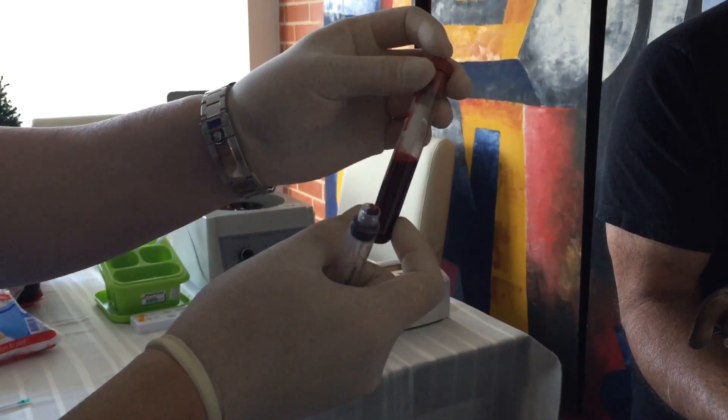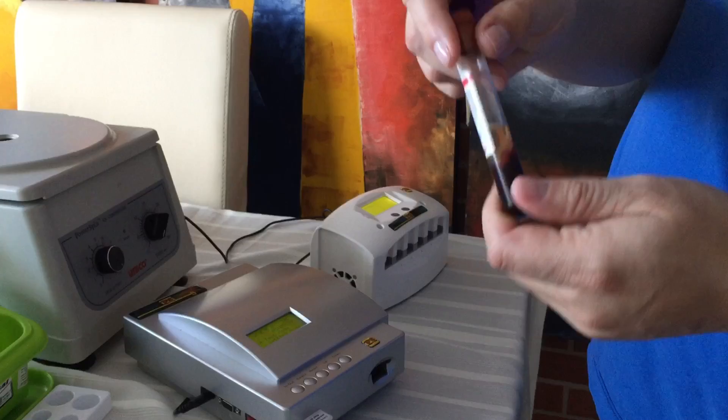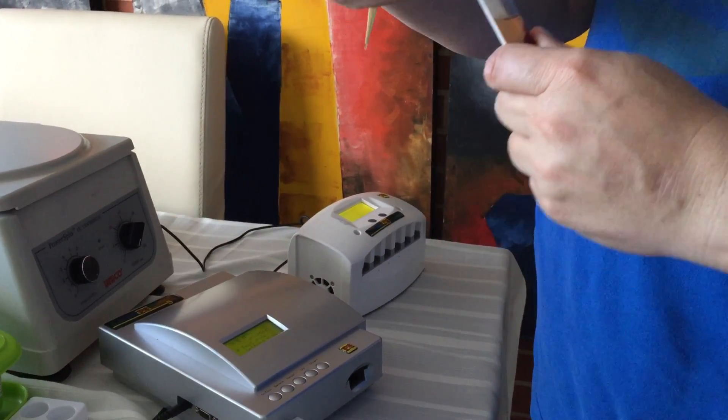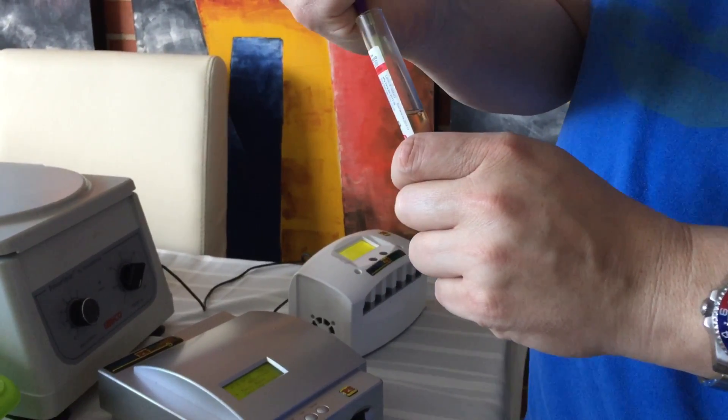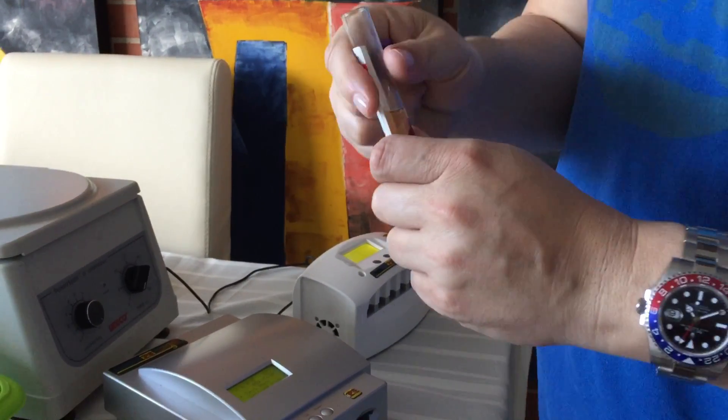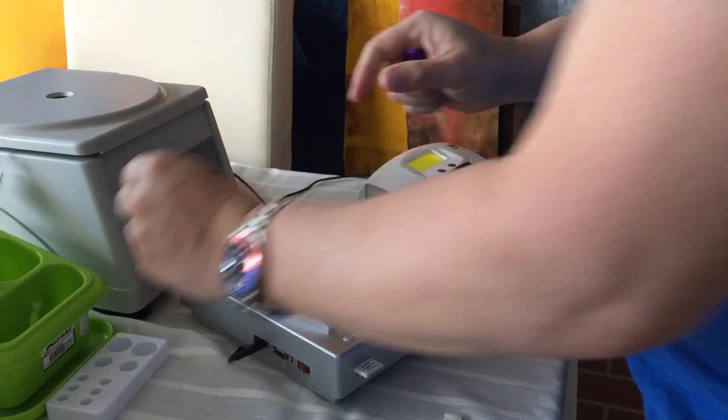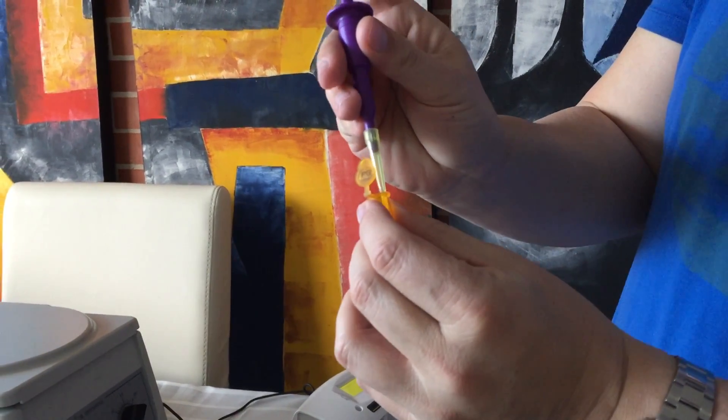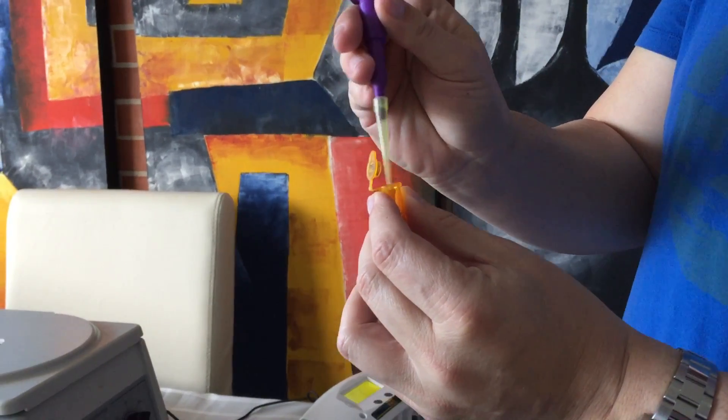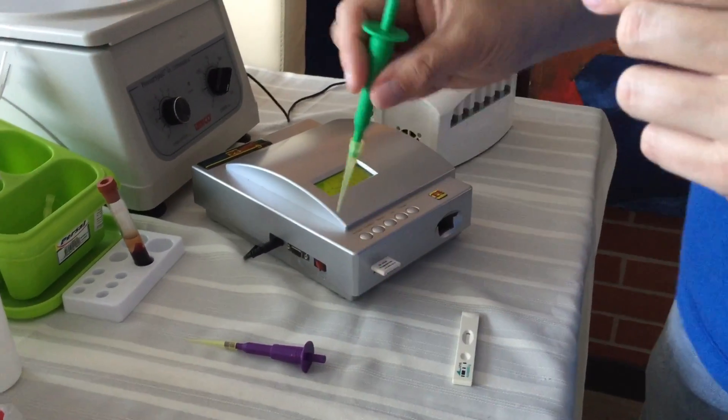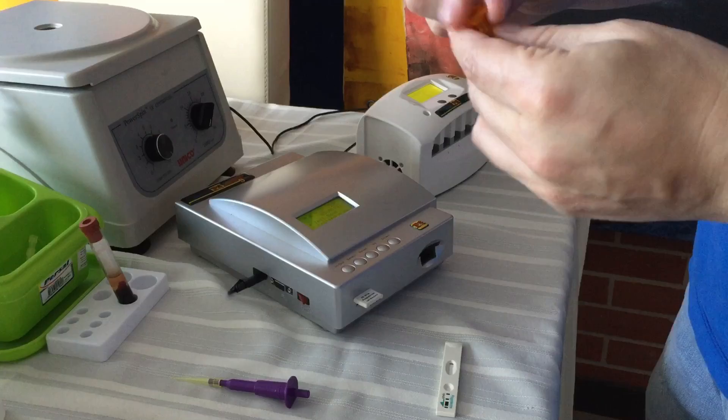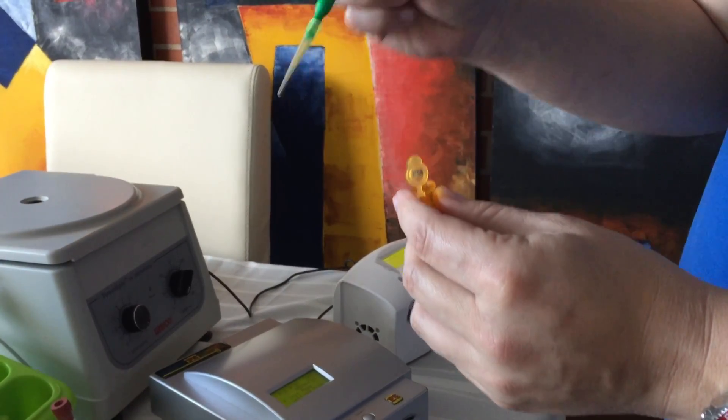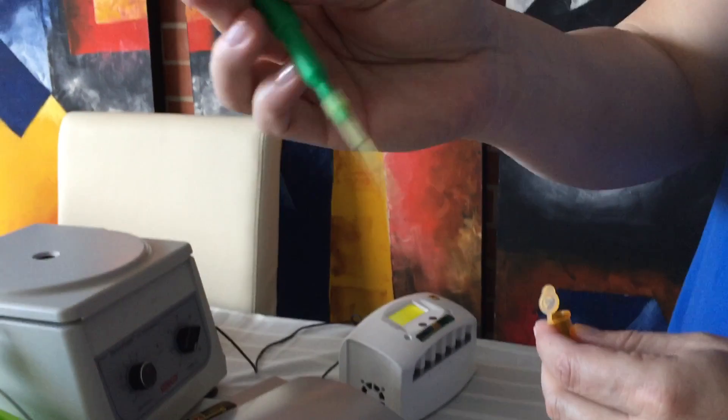Okay, so we have the serum, it's nice and clear. And the testing procedure is you get 30 microliters of serum, mix it in the buffer. You can pipette it up and down or you can just mix it, shake it in about 10 to 15 times. Then you get 75 microliters of the buffer-serum mix, making sure that there's no bubbles.